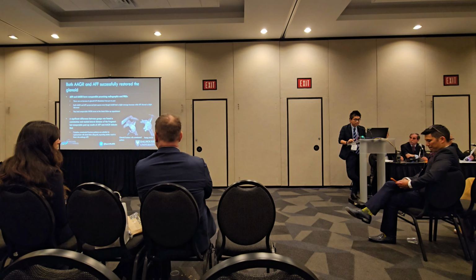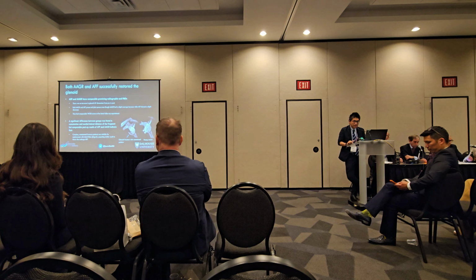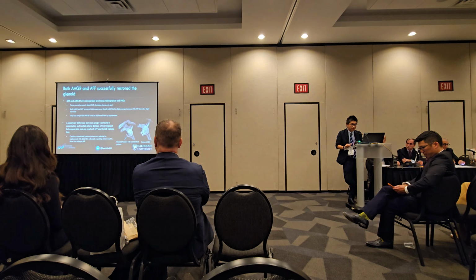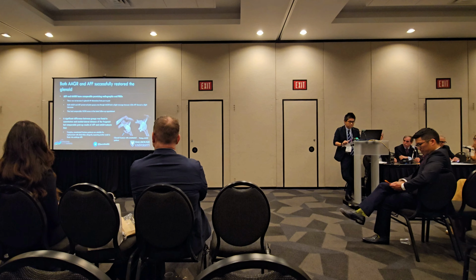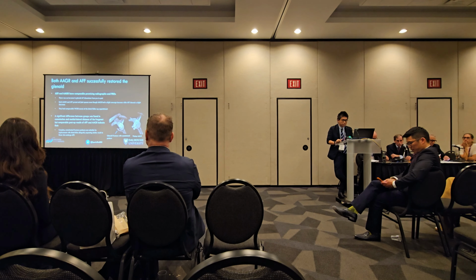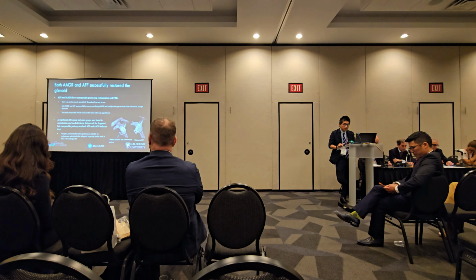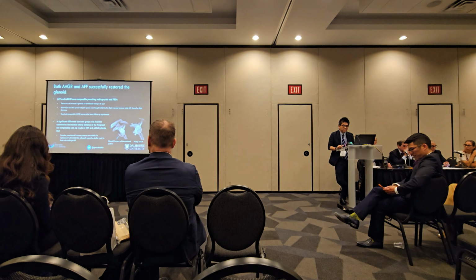In discussion, arthroscopic fracture fixation using EndoButton and arthroscopic anatomical glenoid reconstruction using distal tibial allograft have comparable radiographic outcomes with improvement in glenoid width, and no progression of arthritis. Also, patient-reported outcome measures improved in both groups. A difference between groups exists with the glenoid fracture patterns. In arthroscopic anatomical glenoid reconstruction, more cases with a comminuted glenoid fracture fragment pattern existed.